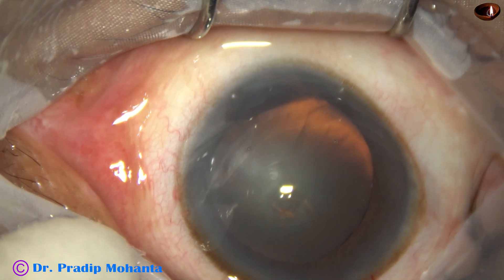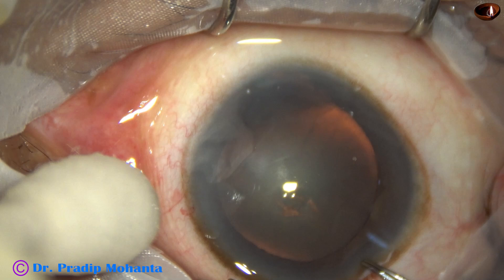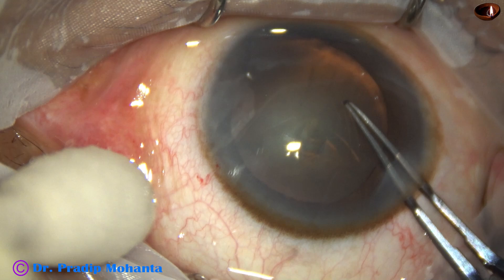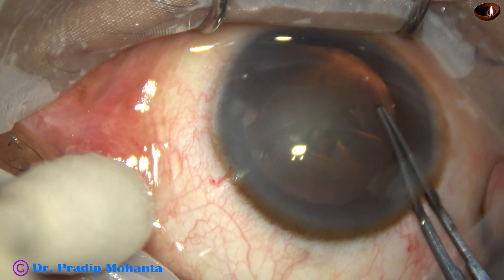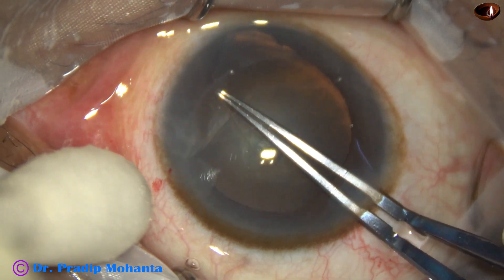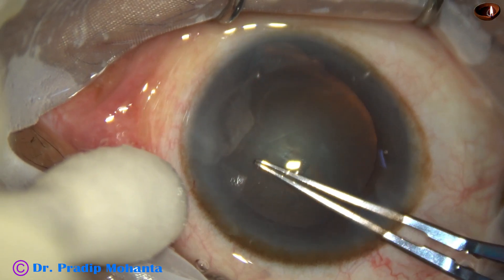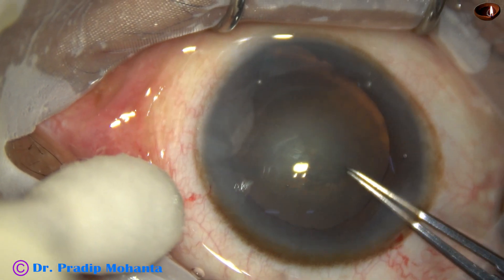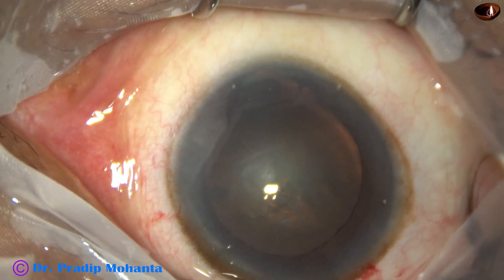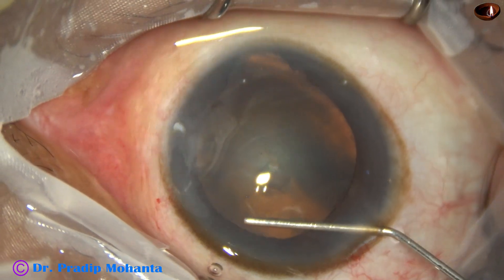Some viscoelastic is placed over the cornea, a bit of clarity is obtained, and now I hold the capsular tag and do a rhexis which is eccentric — it does not go much towards the area of coloboma. The coloboma is more in the upper part.